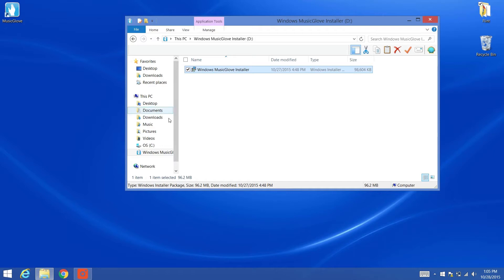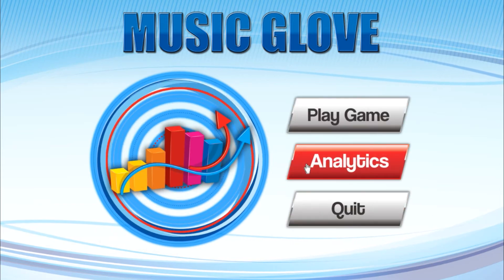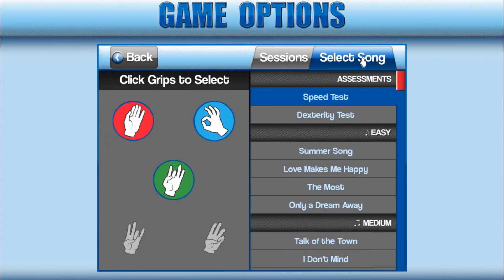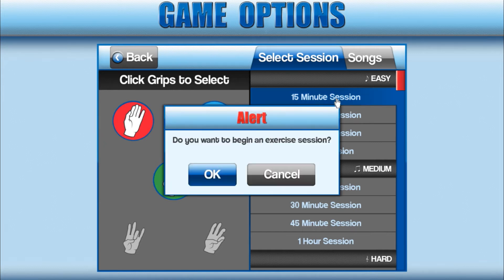Double-click on the MusicGlove icon on your desktop to launch the program. You should now see the MusicGlove main menu screen appear. Select Play Game to go to the Game Options screen. On the left side of the screen, select the specific grips you would like to train. You may select up to 5 grip types. Select Songs to view individual songs from the list or Session to view the session selections. Select any session or song on the list under the desired difficulty to start the game. We recommend starting with a 15-minute session, found under the Easy header.